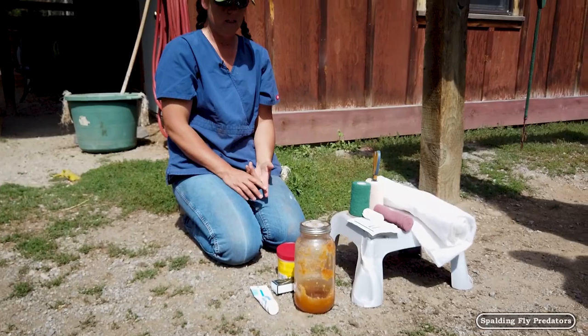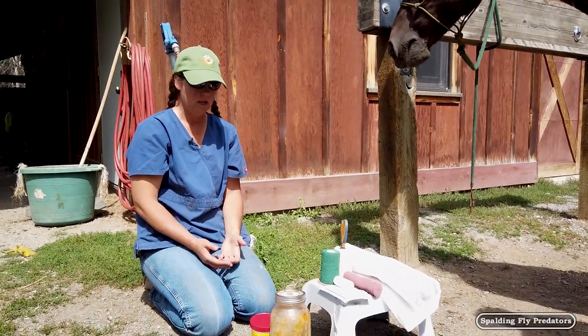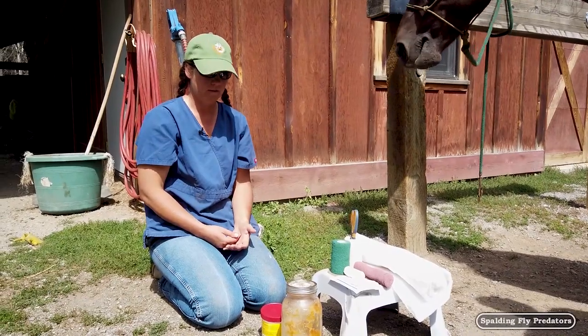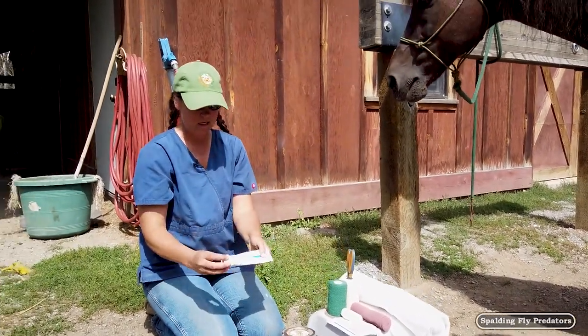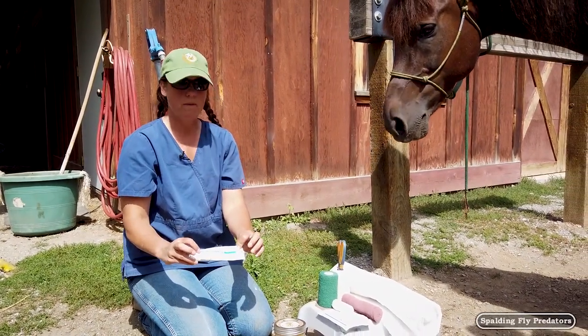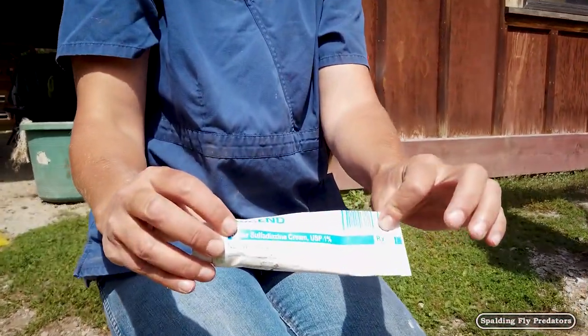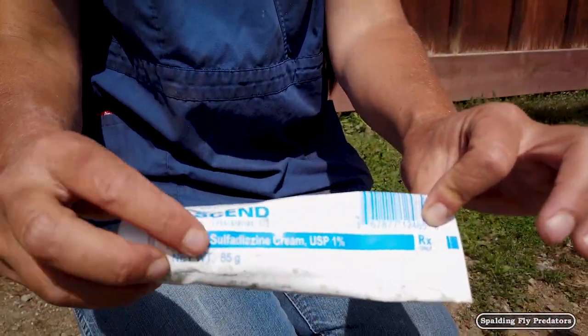I don't like to use anything that is petroleum-based because it puts a seal on that wound and can interfere with the oxygenation of the wound. So we've got silver sulfadiazine cream, which is a prescription item. This is a common human burn cream and it's great for wounds, scuffs, and abrasions — one that we really like.